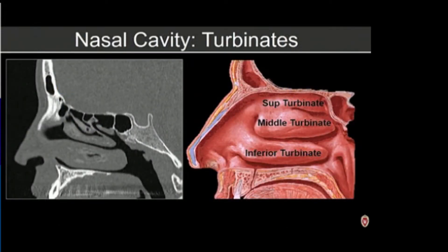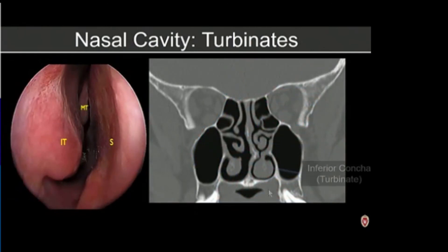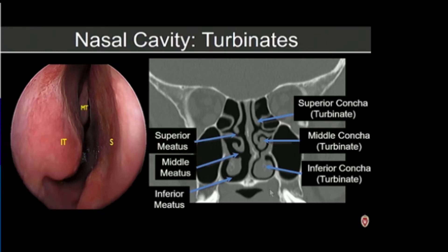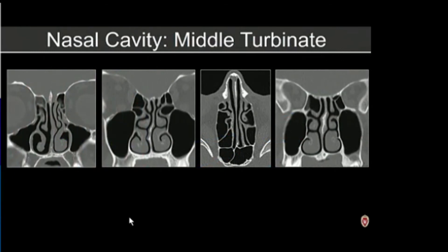Along the lateral nasal cavity we have the turbinates — for the most part the superior, middle, and inferior turbinate, though occasionally a supreme turbinate may be seen. On coronal view we can see the inferior, middle, and superior turbinate, and on their undersurfaces the inferior, middle, and superior meatus respectively. The middle turbinate is a very important landmark for surgeons; they will identify it and may take it down during functional endoscopic sinus surgery if it is contributing to narrowing of the drainage pathway.